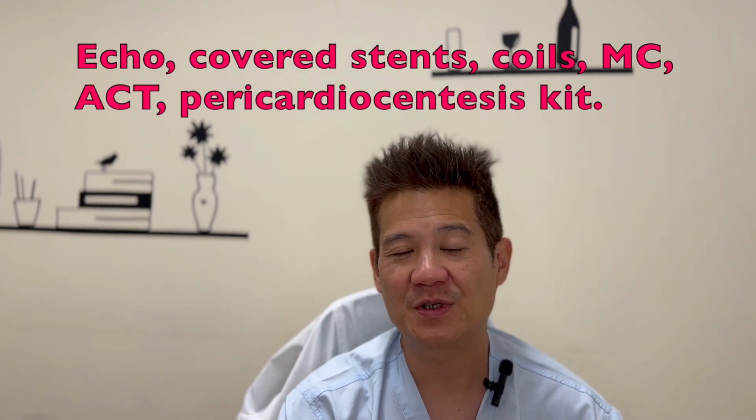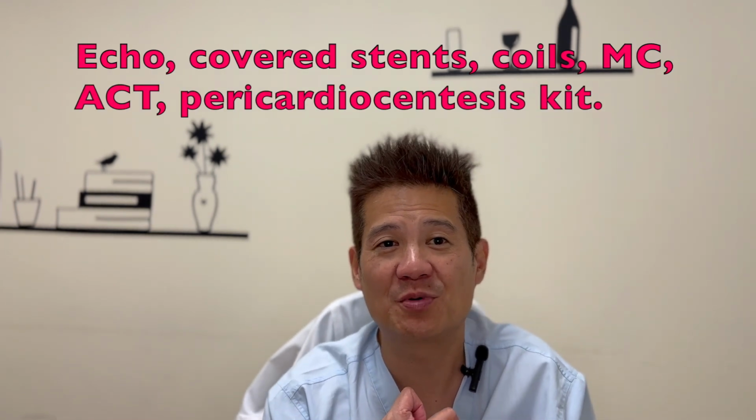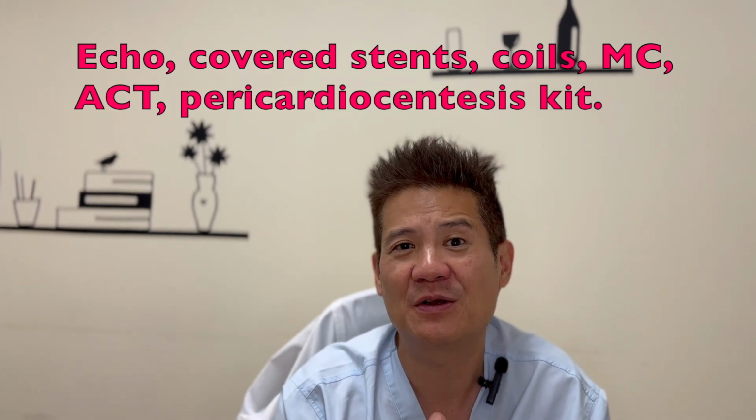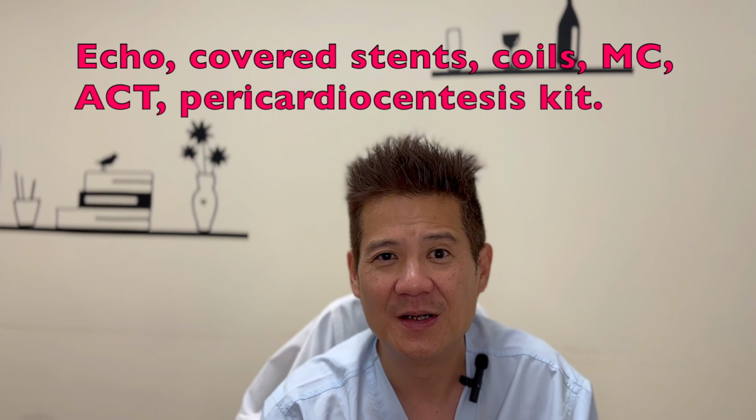So, safe setup. After a lot of emails back and forth between the 147 authors, we decided on what is essential in a cath lab that's going to do CTO PCI, and what is optional but preferable. The 6 essential things for safe CTO PCI are an echo machine, because we need to know when we've caused problems with the LV function, and we definitely need to know if we have pericardial effusion and tamponade.